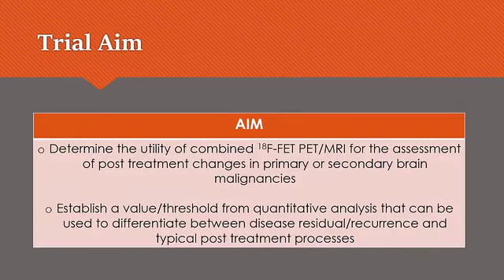The aim of this research was to determine the utility of combined 18F FET PET MRI for the assessment of post-treatment changes in primary or secondary brain malignancies. The principal objective was to establish a value from quantitative analysis that can be used to differentiate between disease residual or recurrence and typical post-treatment processes.